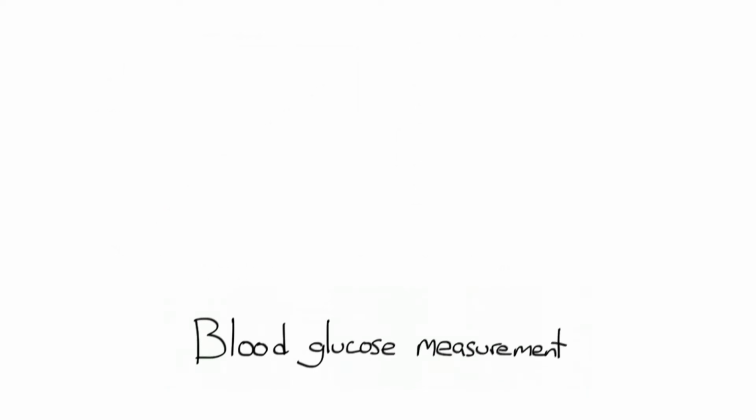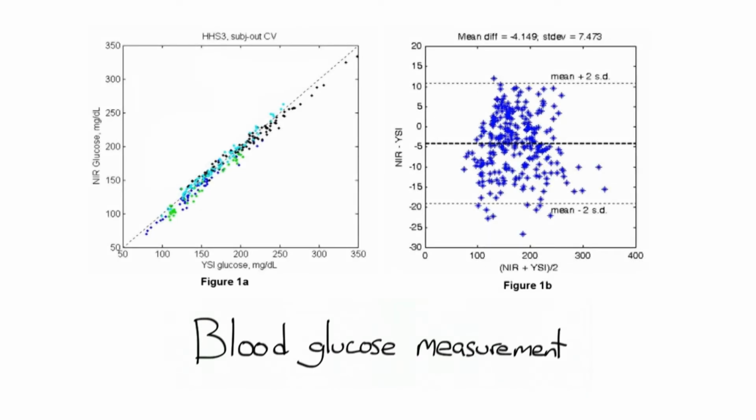A similarly accurate measurement can be obtained in blood samples with varying hematocrit levels. The data shown were generated by Luminous Medical Incorporated, a spin-off of Inlight Solutions Incorporated. Blood was withdrawn from a peripheral vein, then passed into a cuvette and measured with an NIR spectrometer. The left plot is a standard XY scatter plot, and the right is a Bland-Altman plot. The measurement results approach the error of the YSI instrument's reference. These data were part of a package submitted to the FDA.